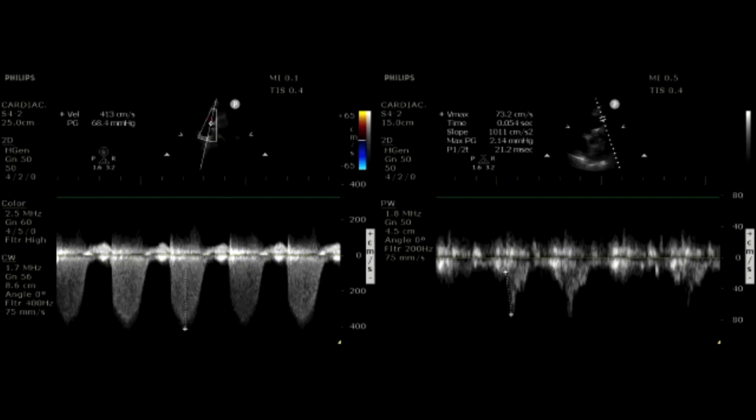I don't want to belabor it for too long. The one thing I did want to mention is related to TAPSE. In cardiology, we don't find TAPSE to be very helpful, frankly. I know there are lots of data, depending upon the heart rate, on the sensitivity and specificity of TAPSE for the diagnosis of PE, and so on. We feel that getting a proper TAPSE measurement is quite difficult, because you're often not lined up. The Doppler beam is not parallel to the right ventricular free wall, and that introduces all kinds of errors.